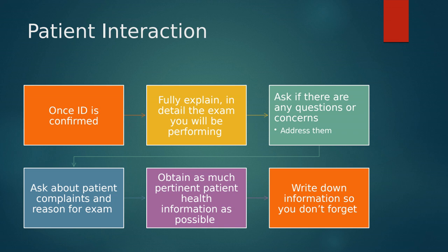There are a lot of patients who have the same first name and last name, so it's very, very important for you to confirm also with their birthday. And then there have been times where birthdays align as well, so you're confirming it with the physician. Those situations get very tricky. So again, we're making sure that we are confirming the ID.